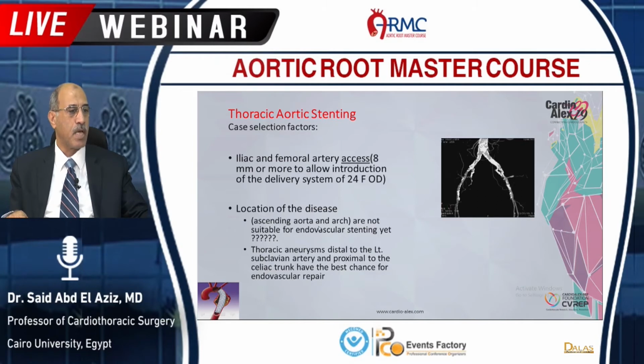Here, ascending aorta and arch are not suitable for endovascular stenting yet, but now there are fenestrated grafts or branched grafts for the arch, but not fit for all cases. So we have to say that endovascular stenting is not yet the standard in the arch cases. The thoracic aneurysm distal to the left subclavian artery and proximal to the celiac artery, those are the best chance for endovascular repair.